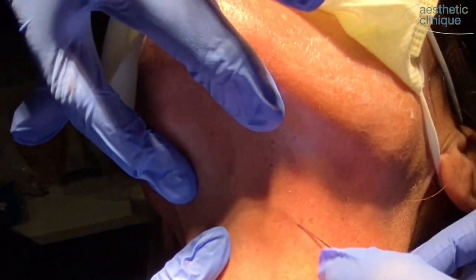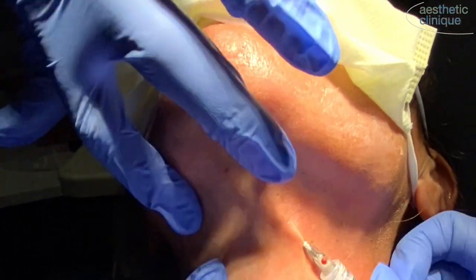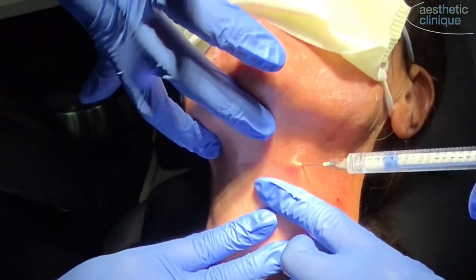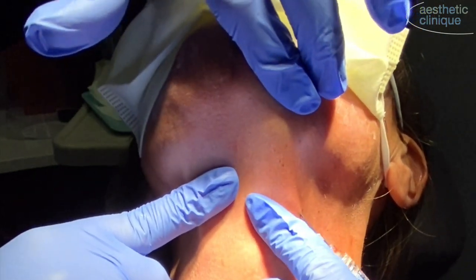This is the fifth pilot hole, which is used to inject in the submental area and upper medial neck. We continue to inject in the subdermal plane, superficial to the platysma, and we inject about 1.5 cc's in this area with the 4 to 1 dilution.